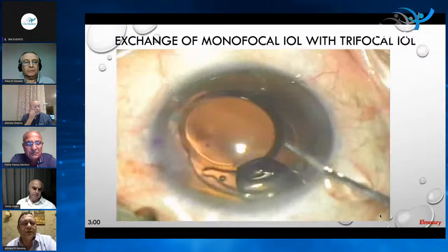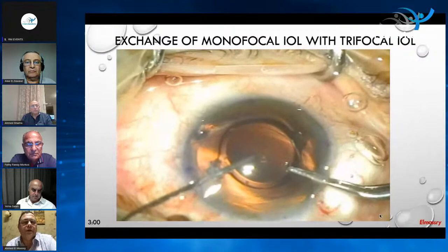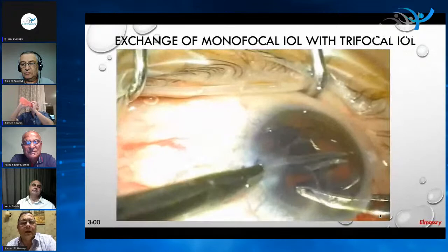And then he went away for 6 months and came back, and he told me, I want to put in a trifocal instead of the monofocal. I asked him why we didn't choose the trifocal from the start. He told me, I was convinced, but my friends told me it's preferable to put in the monofocal. You don't know what is the result of these new trifocals. But he came back and said, my job necessitates that I don't wear glasses all the time. So here may be the first time to exchange a monofocal IOL with a trifocal IOL.